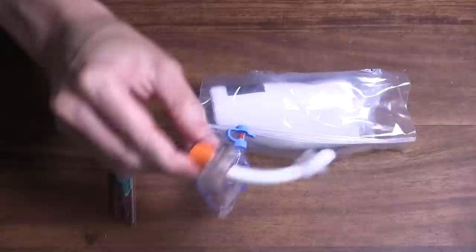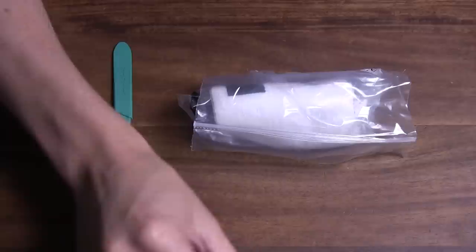And either an ET tube or a trach appliance, whichever one you want to use for the individual procedure you're doing each month. Okay. So now let's go through the procedure.